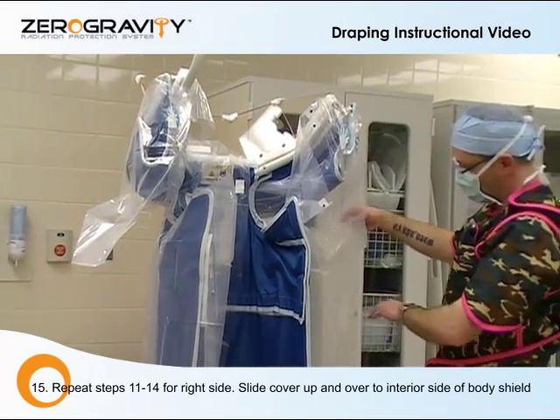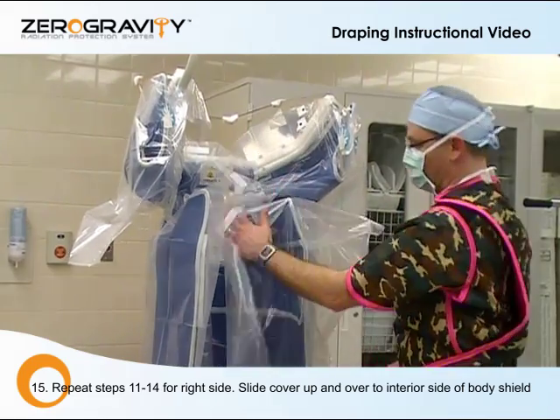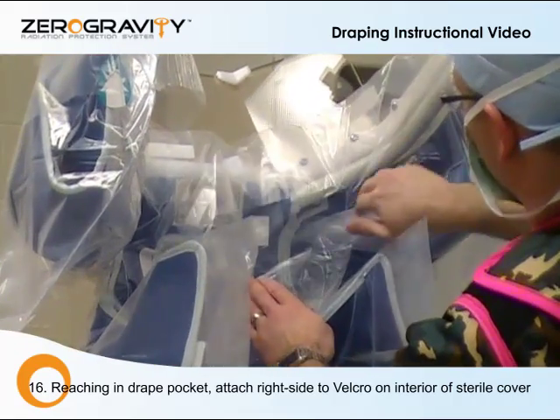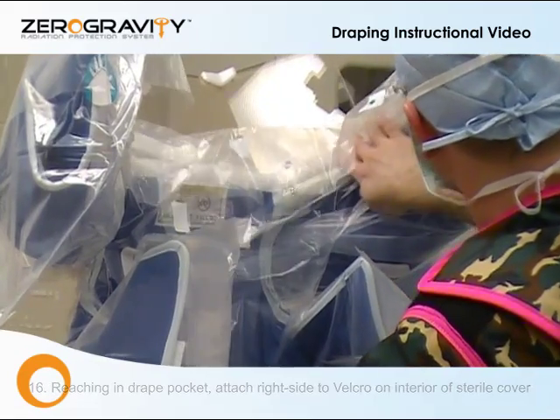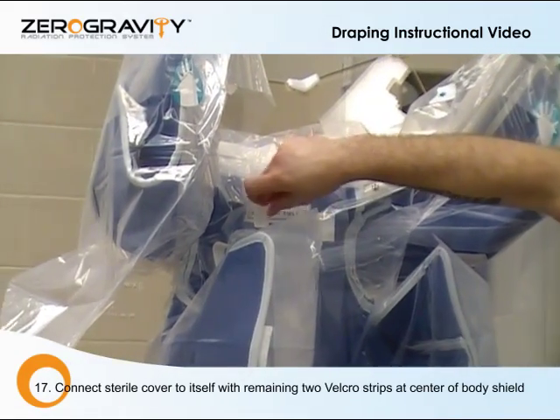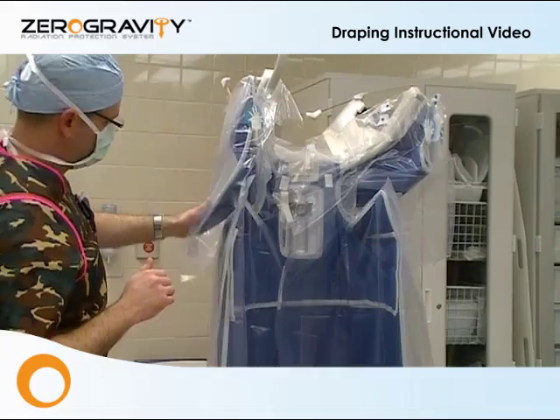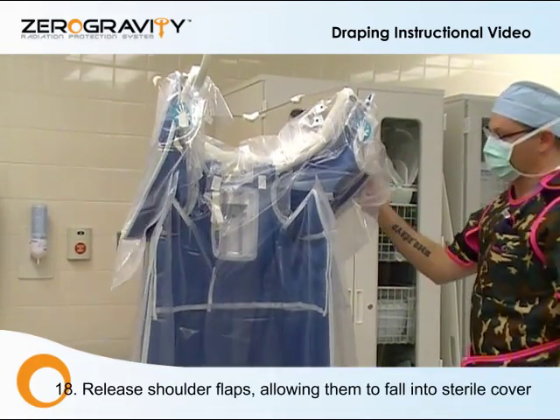Same thing on the other side. Pull this corner out. Maintaining sterile, you reach in here, up and over. Same thing at the top — place the Velcros where they lay. Last step: two Velcros down the center. Place appropriately. Lock the arm shields down. Very simple.